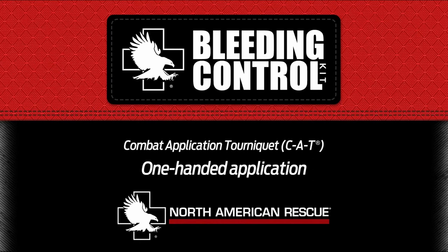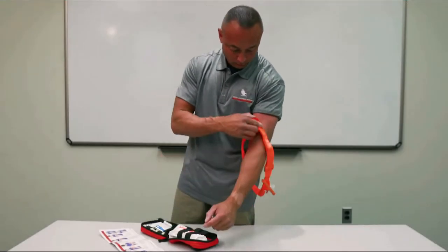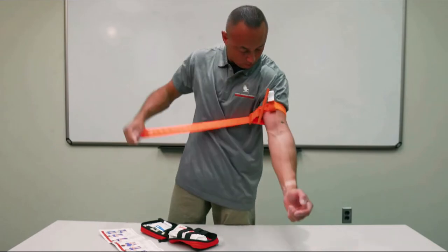Combat application tourniquet — CAT — one-handed application. Insert the injured limb through the loop in the band and position the CAT 2 to 3 inches above the bleeding site, directly to the skin. Pull the band tightly.